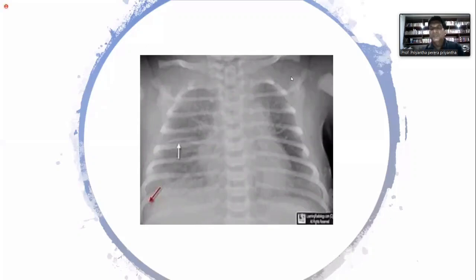In these babies, the alveolar fluid absorption is delayed, so they have tachypnea and grunting because the alveoli contain fluid. It can be mistaken for surfactant deficient lung disease in a preterm baby, but in a term baby, it is the most likely diagnosis. And again, more common in babies born by elective cesarean sections.